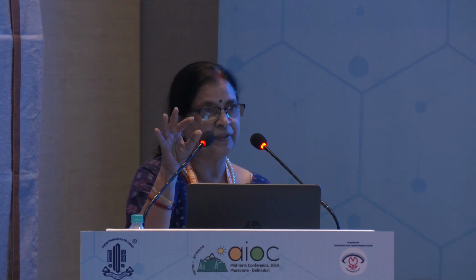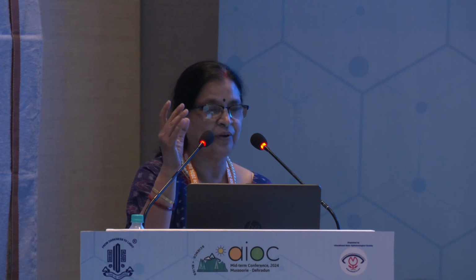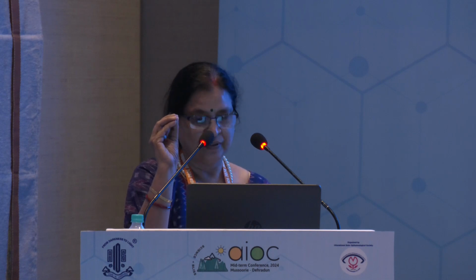So all your hard work goes wrong. So what have we forgotten here? The moment a patient comes with defective vision, we suddenly jump into "go do the biometry," and we most likely forget the ocular surface, which is the most exterior part and is subject to a lot of stress and contamination also.